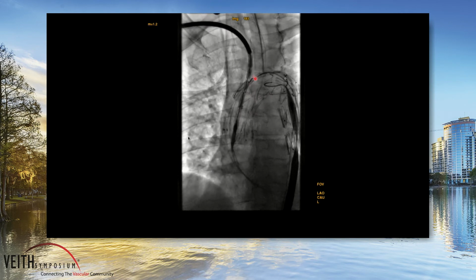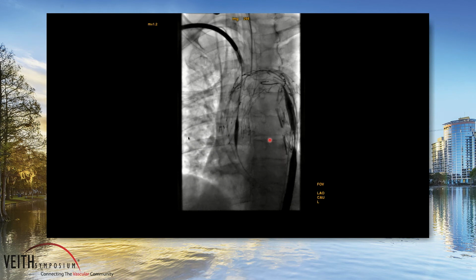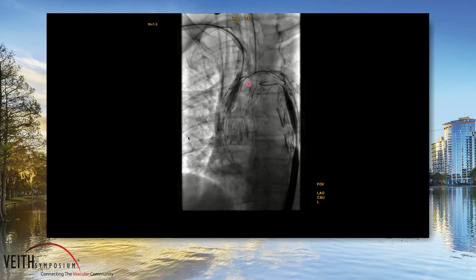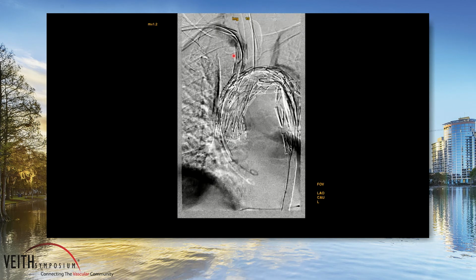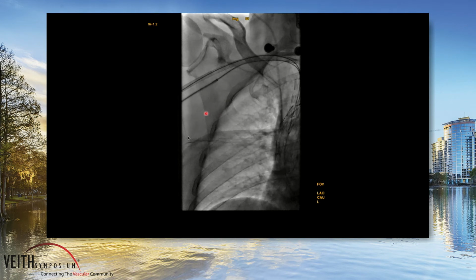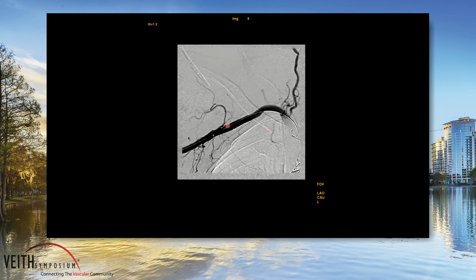That I will soon release here. There we are. And then we shoot a small angio to check that we have a good seal and a patent carotid and right subclavian artery. And you can see that after having closed the Proglides here, we deploy a short covered stent to get a perfect seal at the level of the puncture of the right axillary.